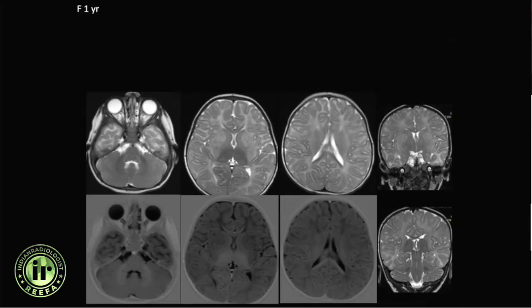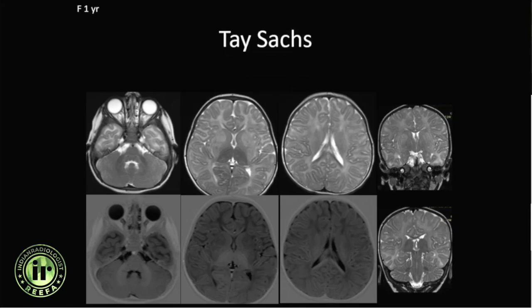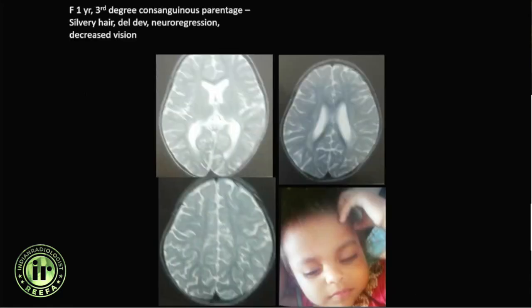A one-year-old child showed diffuse abnormality in the basal ganglia as well as hypointense signal in the thalami. This is Tay-Sachs syndrome — GM2 gangliosidosis.